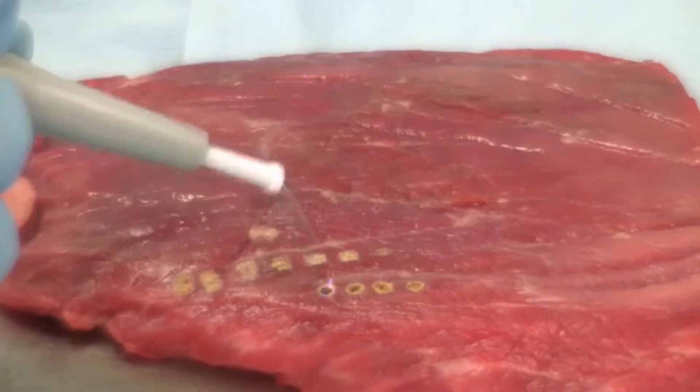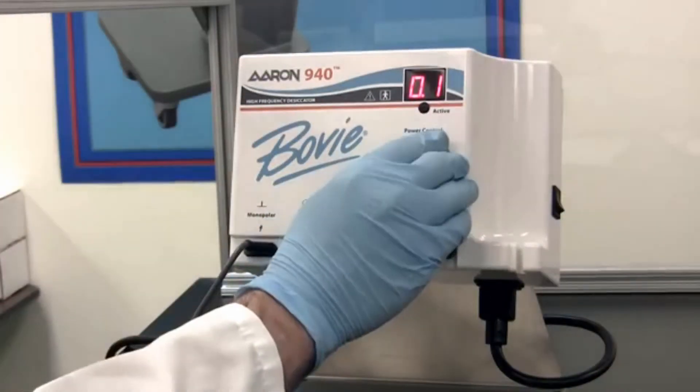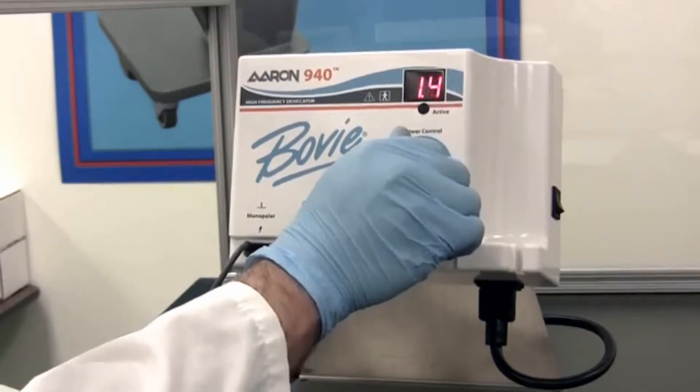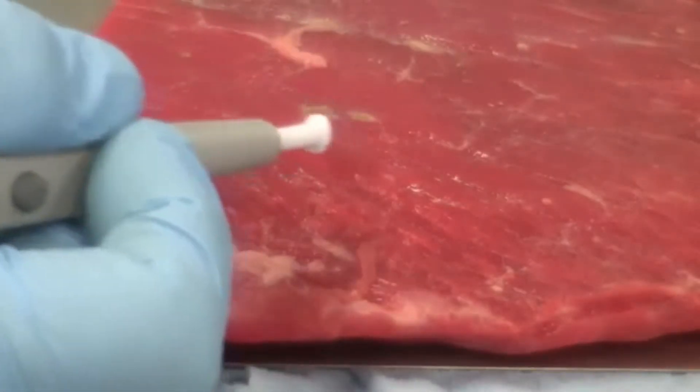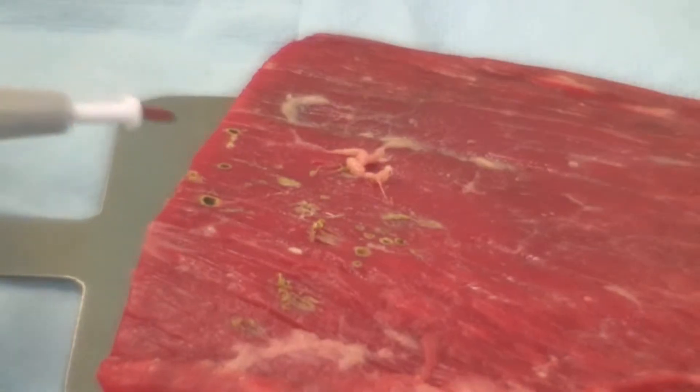You need to avoid applying too much power to the tip. Be sure to adjust the power conservatively at first. As you use the Aaron 940 desiccator for a particular procedure, you will become accustomed to the settings you need to use.